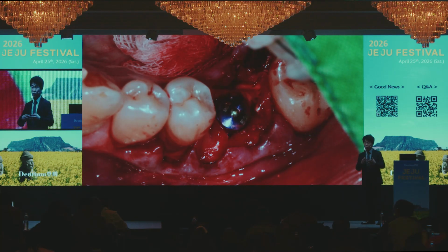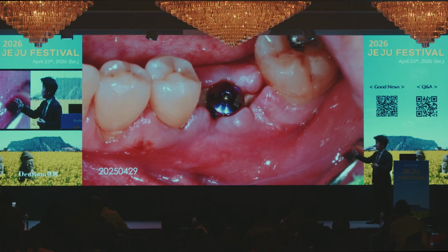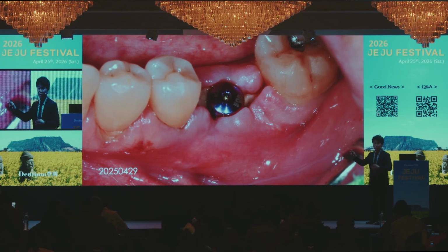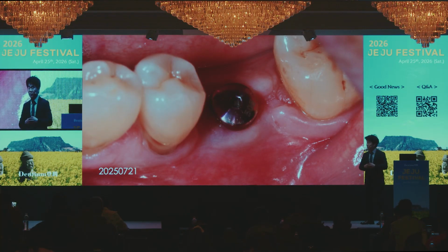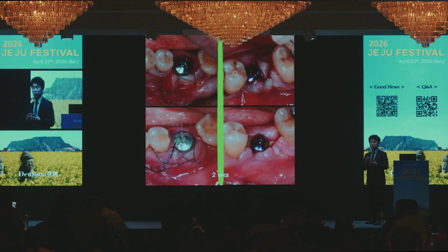This is another case. This is the conventional collagen membrane. We always see this healing pattern. It is not eventful healing. Just wait, we get secondary intention healing, but the initial healing pattern is different. So I think that is the advantage of collagen X1D.